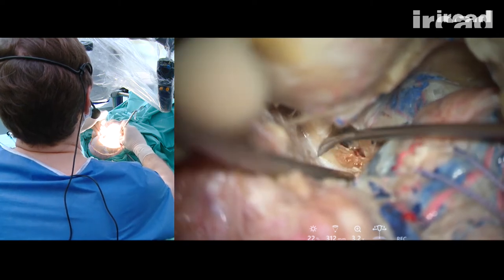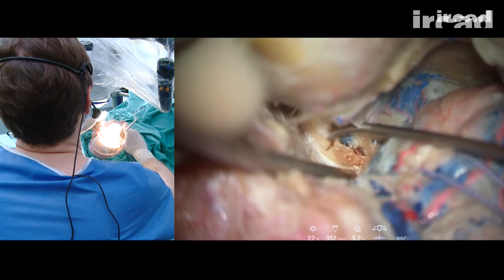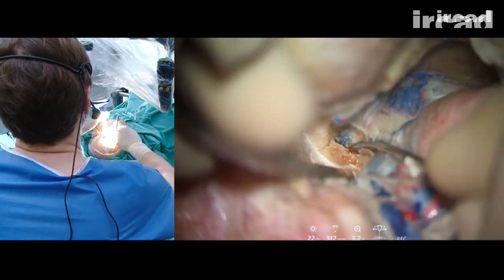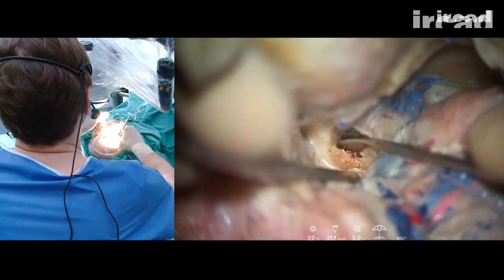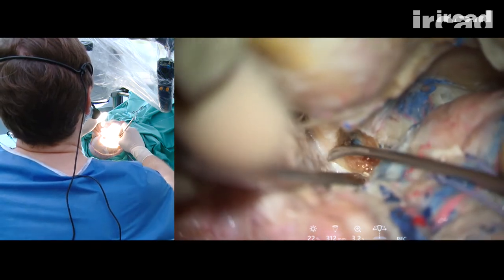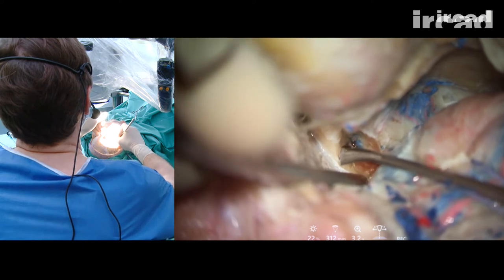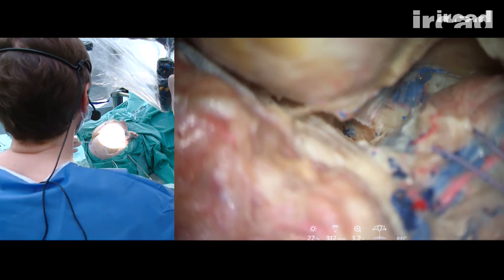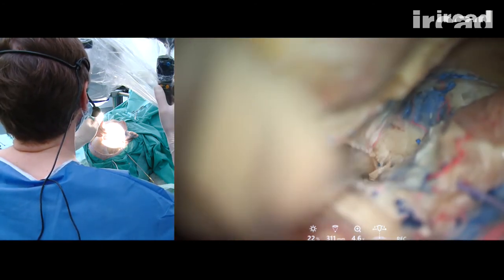If the tip is not moving properly, it can mean that there is a carotidoclinoid foramen, which means a ring around the carotid artery, which could be the case here, because I have the feeling that there is a tiny attachment still at the tip of the clinoid. So in this case, you have to be very careful taking the tip out.